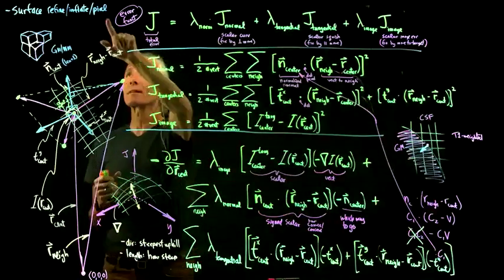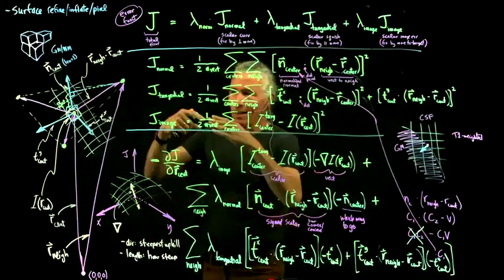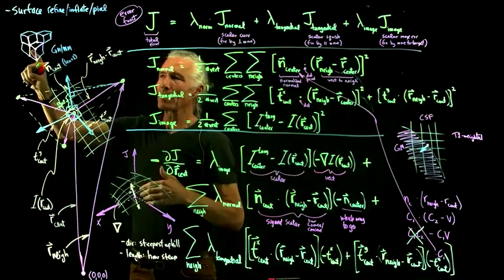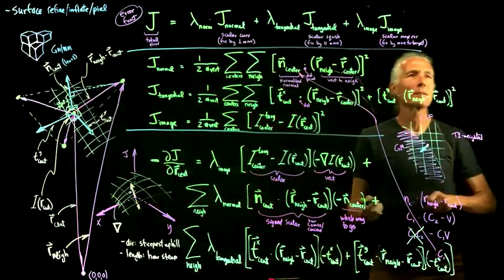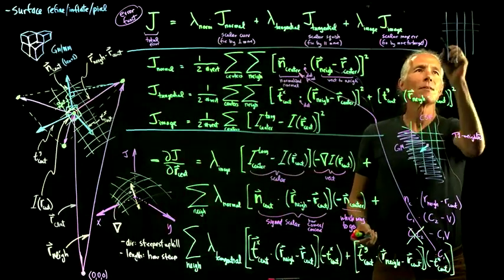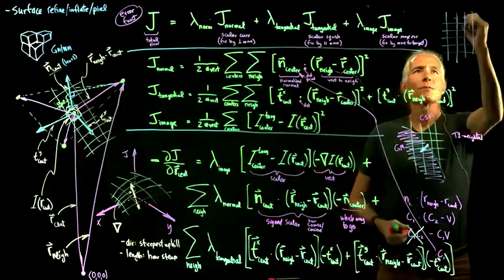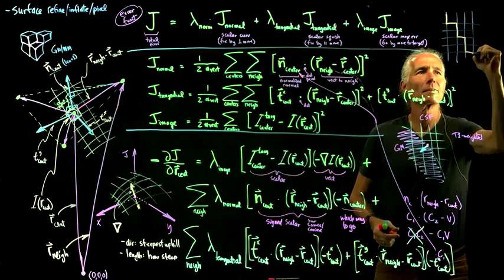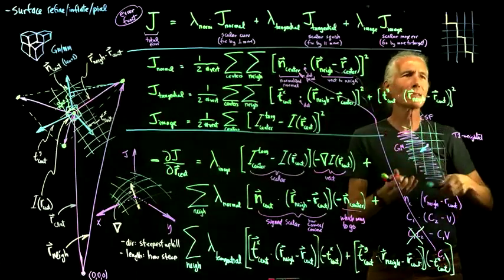And you can do all different things with this. So you could try to refine the surface. So we start off with this very blocky surface, but what we could do is, if we have a surface that's just going over, say it's trying to follow the gray matter, but it's just going like this, something like that. So that's not a very good estimate of the gray matter.